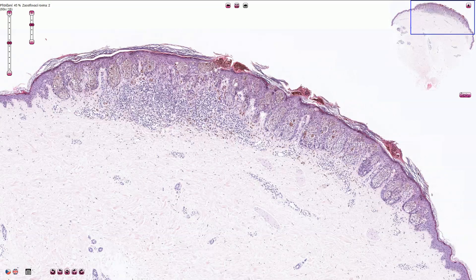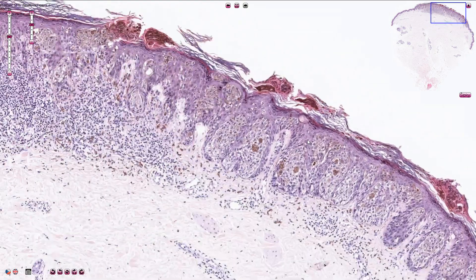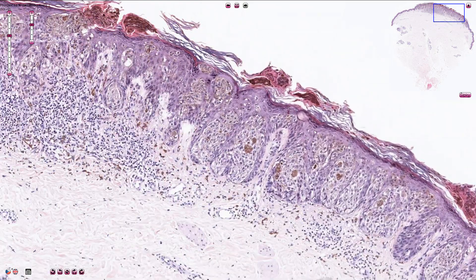Let's compare the previous benign compound nevus with this superficial spreading melanoma. The epidermal melanocytic nests are quite irregular; however, more importantly, we see superficial spreading of the atypical melanocytes to the upper portion of the epidermis.